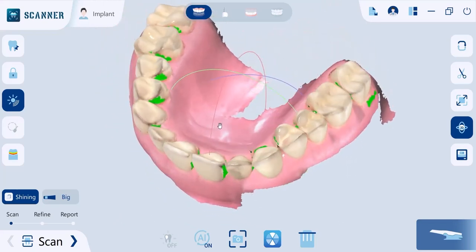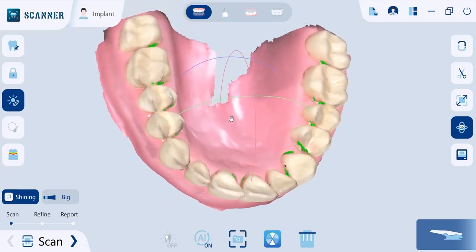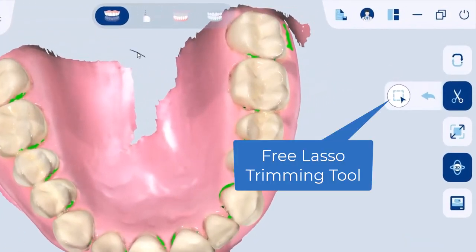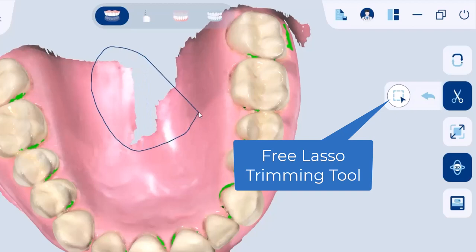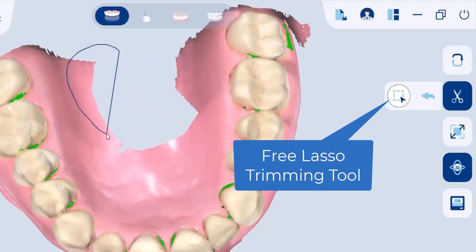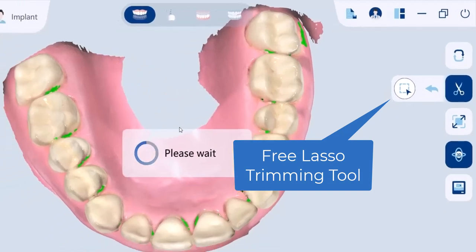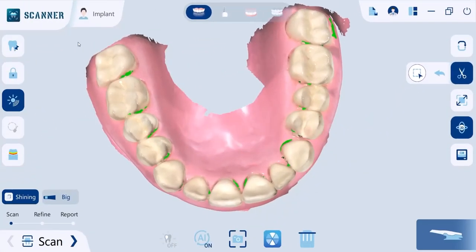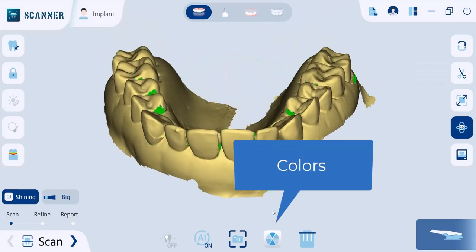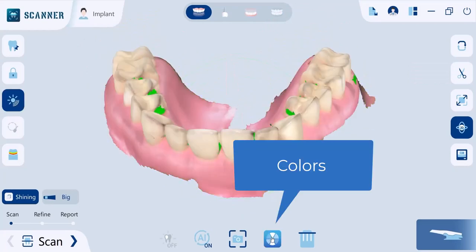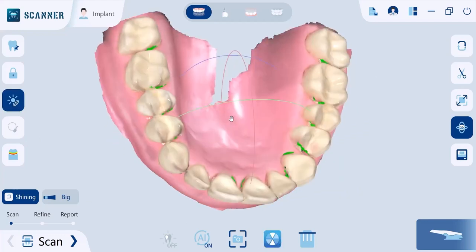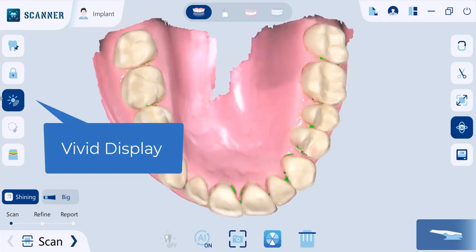After finished scanning, here are some features to enhance your model. Use the free lasso trimming tool to remove unnecessary data. According to your needs, you can switch between monochrome and the patient's hard and soft tissue actual color. You can also use the Vivid Display Mode for better visibility.